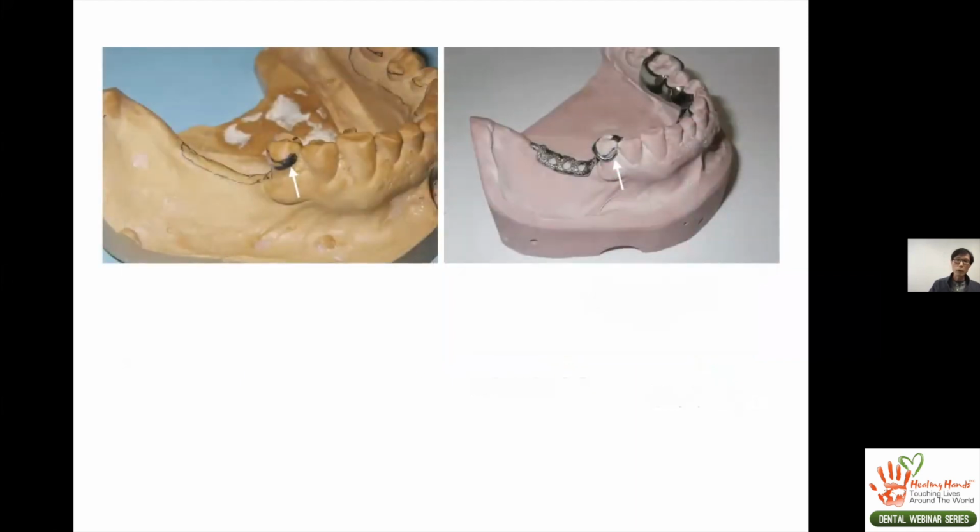So this is one patient case that shows how we designed a clasp assembly. If you look at the distal facial, it is usually more occlusal in terms of height of contour. So we basically shaped the distal facial to lower the height of contour in the gingival direction, and then prepared some concavity or depression on the mesiofacial to ensure a good amount of undercut for retention, and then the framework was fashioned in that way.